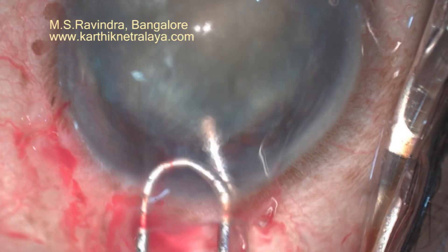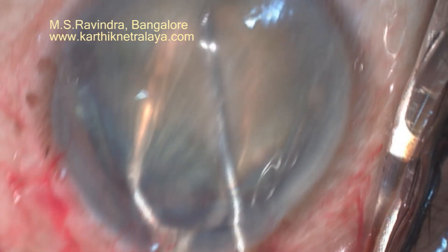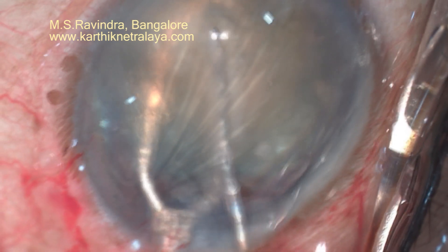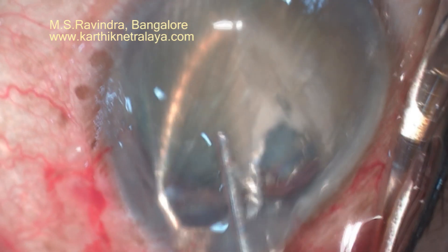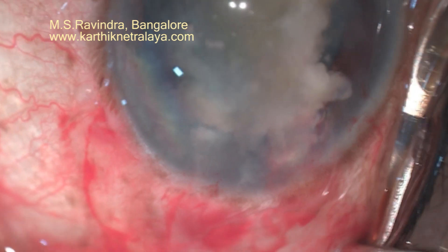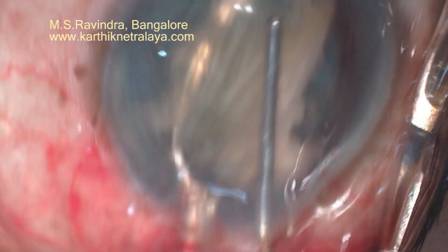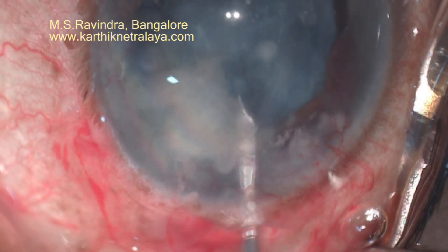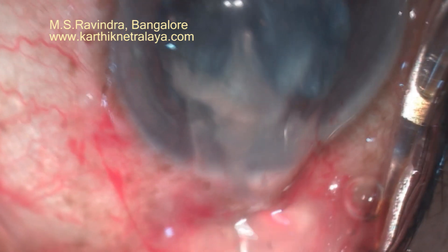By manual rotation, bring the nucleus into the anterior chamber. Support it with the special mini wire vectis and bisect it. With a few attempts it's possible to bisect it with the cannula itself. Remove one bit of nucleus; as you can see, before entering it's continuously infusing viscoelastic into the anterior chamber. Support the second half of the nucleus and guide it out — the guiding should be in the direction of the tunnel, slightly pressing the floor of the tunnel.